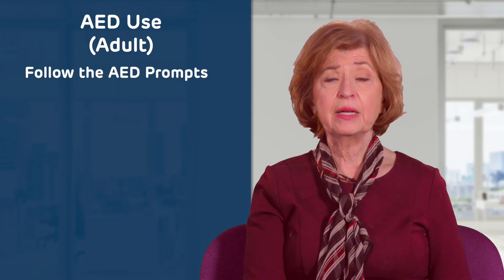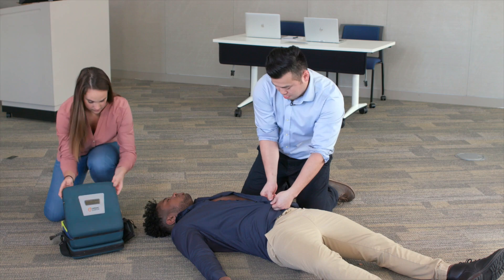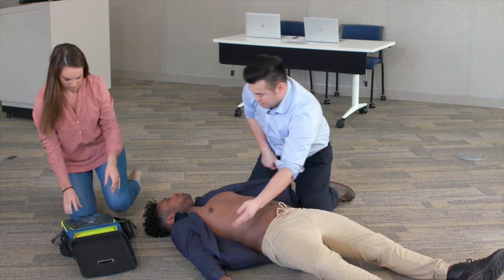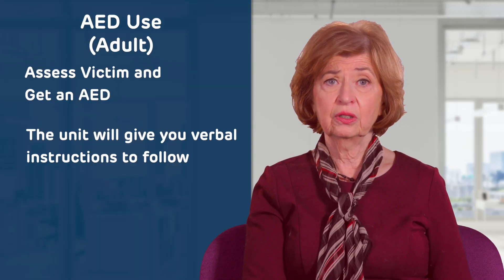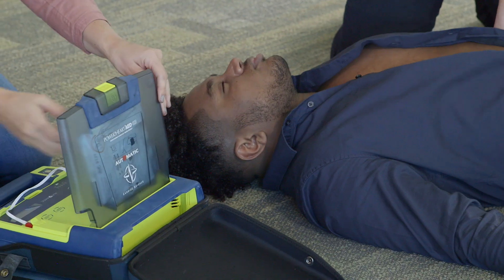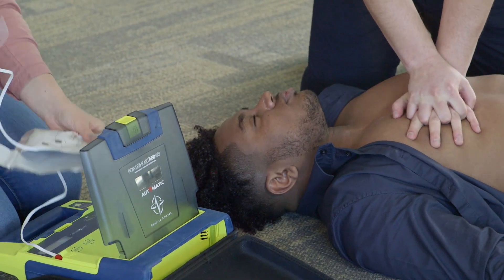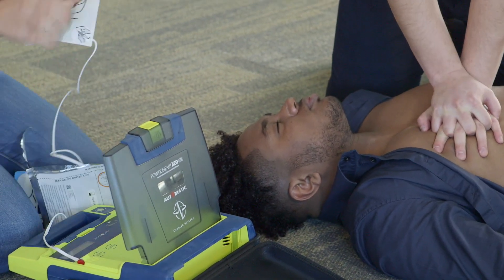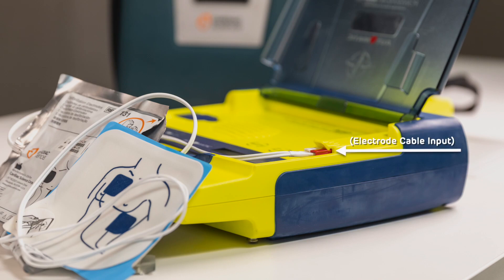Follow AED prompts. Once the AED is on site, open the unit and turn it on if needed. The unit will give you verbal instructions to follow. If you have help on site, continue CPR while the AED is being set up. Plug the electrode cable attached to the pads into the unit if they are not already connected.